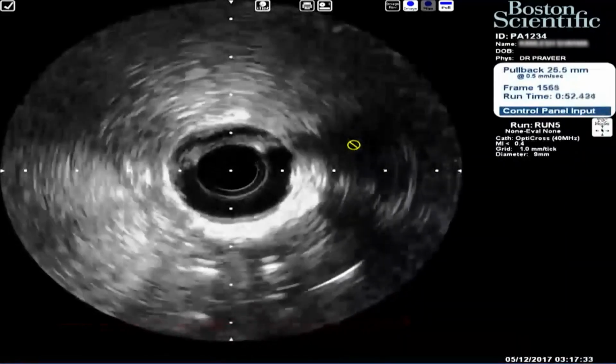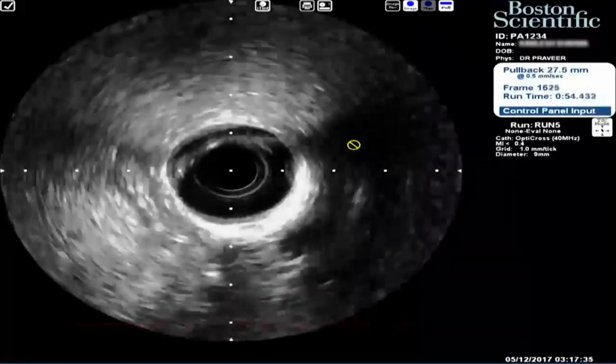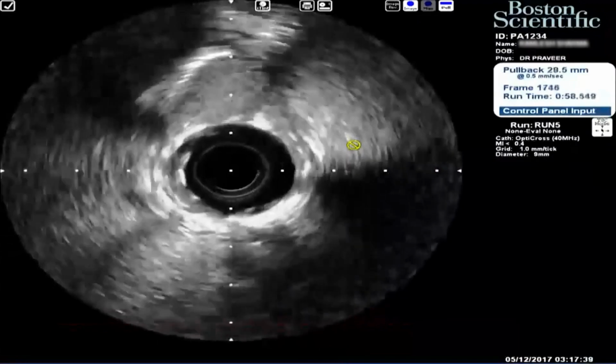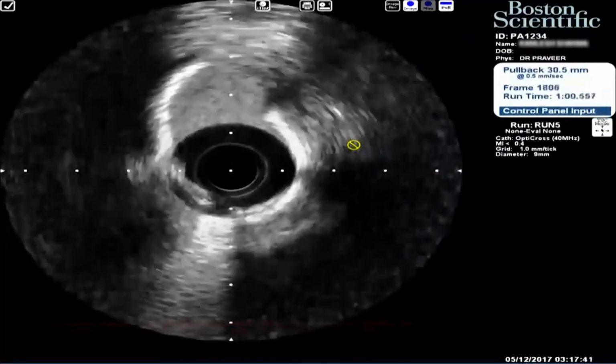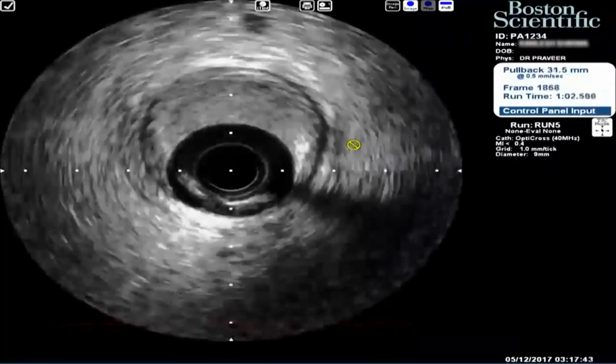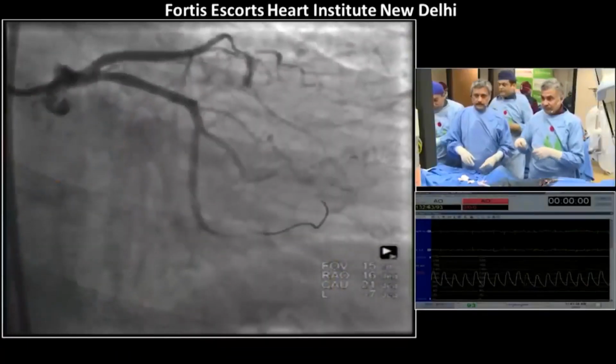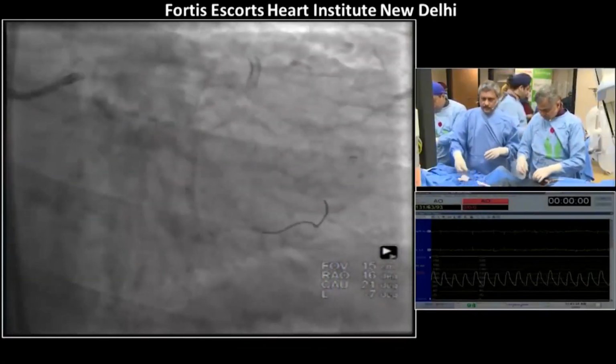But in this case, what are your options? Your options are to take a 2.5 non-compliant balloon at short 30 atmospheres and potentially cause rupture, or to take a constrained balloon higher up. But anything you do here is good. Just the same class as your stent.